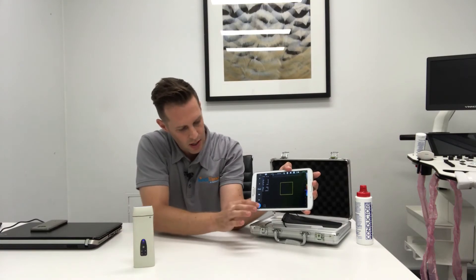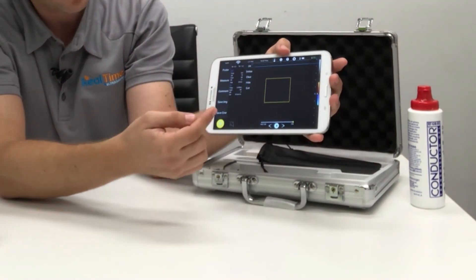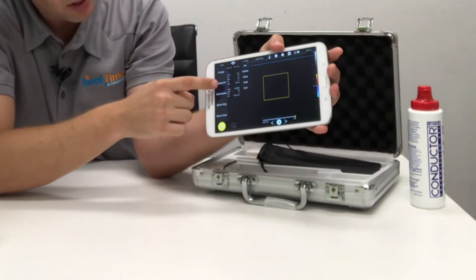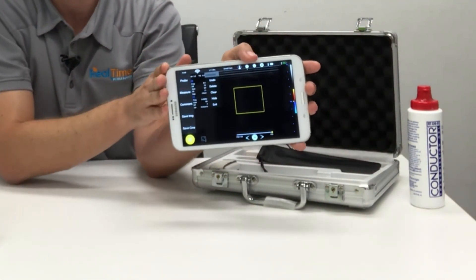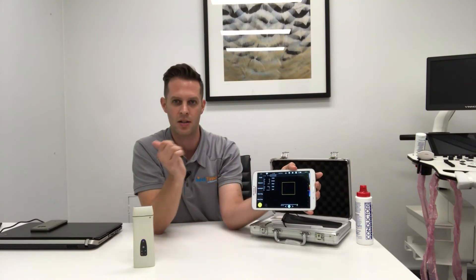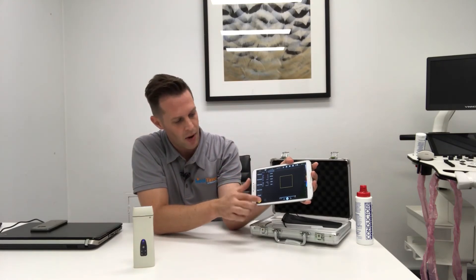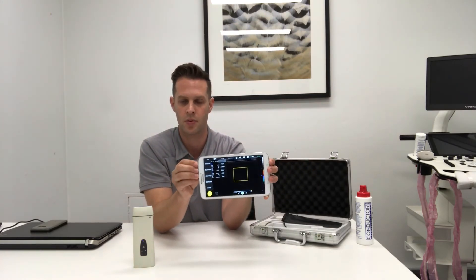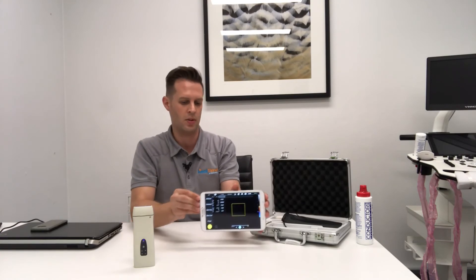If you freeze the image, you can move into your measurement and comments menu. You can touch the screen, get your keyboard up, and write whatever you want. You can do measurements — distances, angles. On the Windows version of the software you have all the advanced measurements as well, including obstetrics and other applications. You can also save images directly to your device or as a CineLoop, whether it be a tablet, iPhone, or computer.